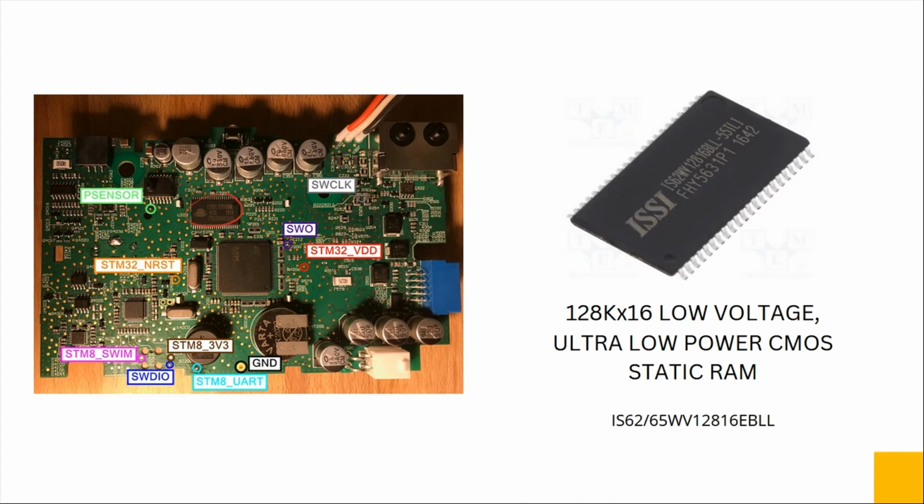The next chip that we have on here is for static RAM. This is basically going to be storing data on the device. Similar situation, we don't know what data they decided to put on this, whether it be, say, image data for displaying on the LCD screen, or data for calculations. We don't know, but obviously the main point of it is storing data that the main microcontroller or the auxiliary one doesn't have enough space for.